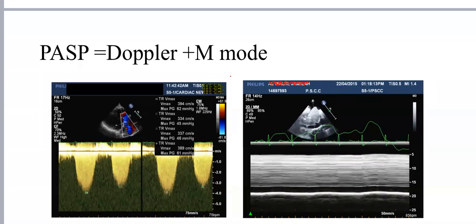Okay. So the problem with the pulmonary artery systolic pressure, lack of accuracy, comes from different sources, one of which is the imprecision of estimating the RA pressure from the IVC. It's not so accurate, by the way. For example, a patient on a ventilator, the pressure is very high and the IVC will be dilated and uncollapsible.